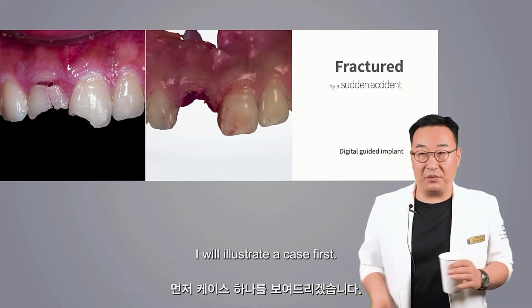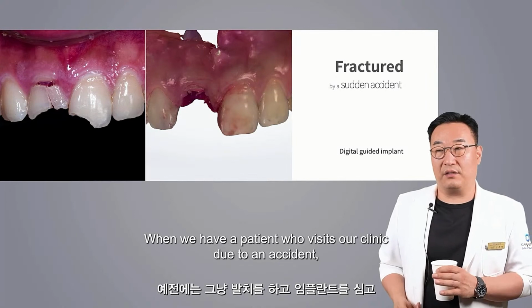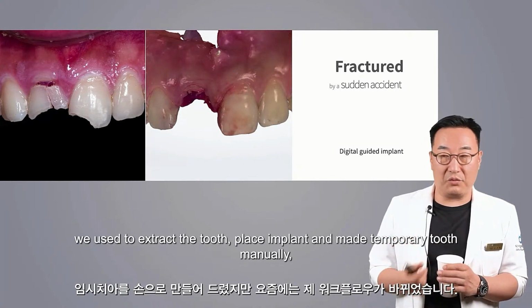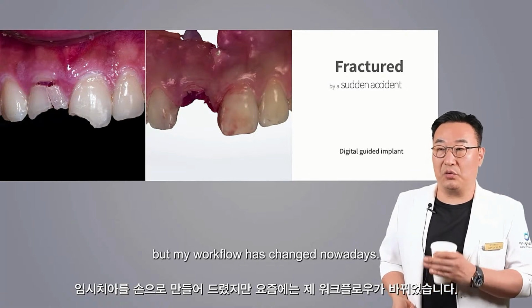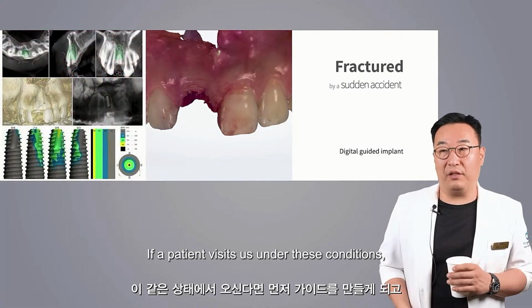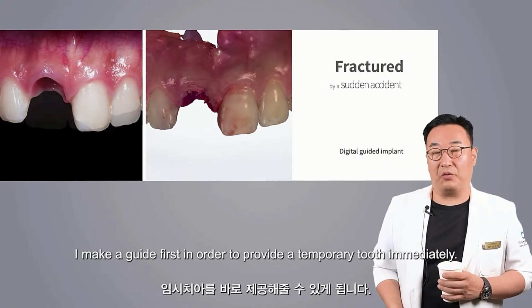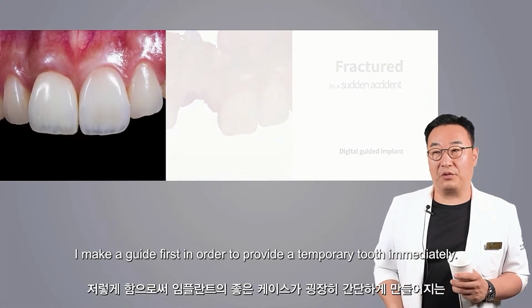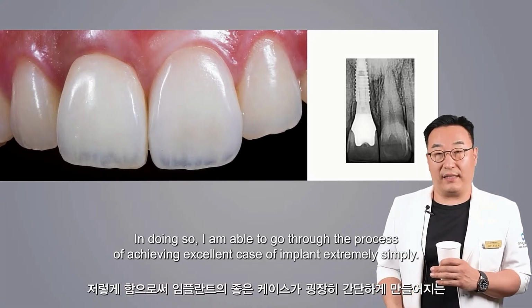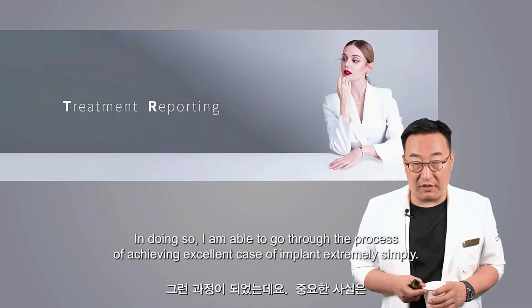I will illustrate a case first. When we have a patient who visits our clinic due to an accident, we used to extract the tooth, place implant, and make a temporary tooth manually. But my workflow has changed nowadays. If a patient visits us under these conditions, I make a guide first in order to provide a temporary tooth immediately. In doing so, I am able to go through the process of achieving an excellent implant case extremely simply.